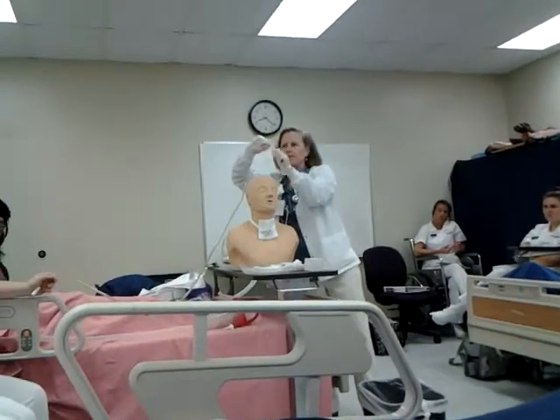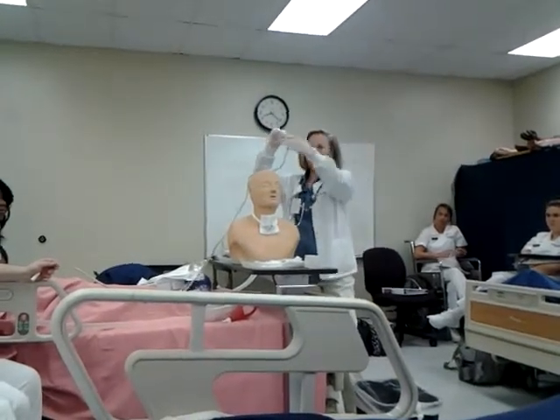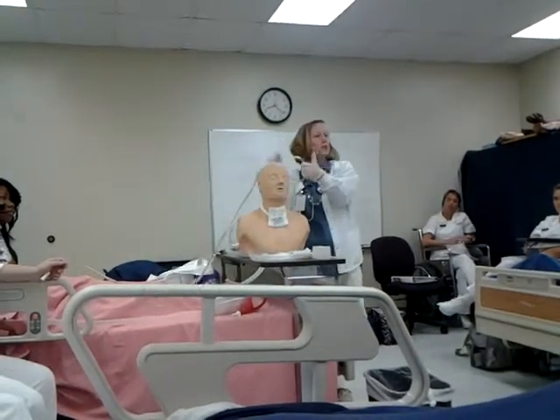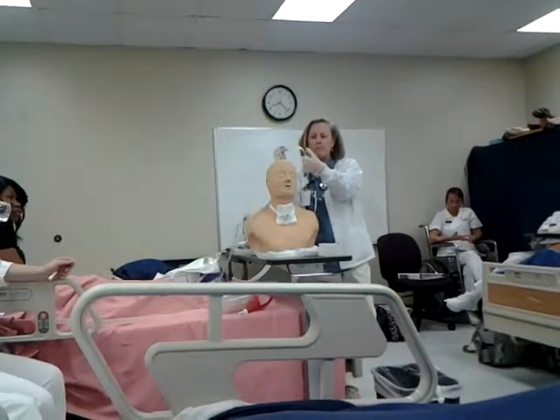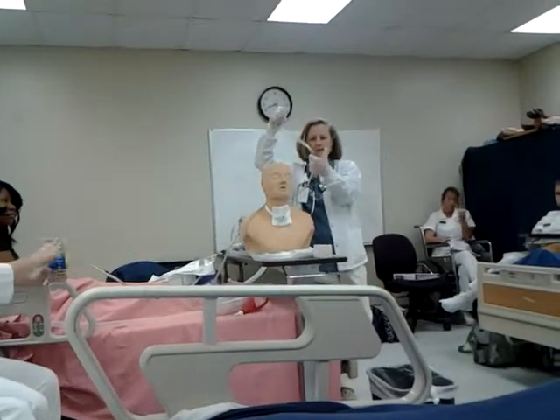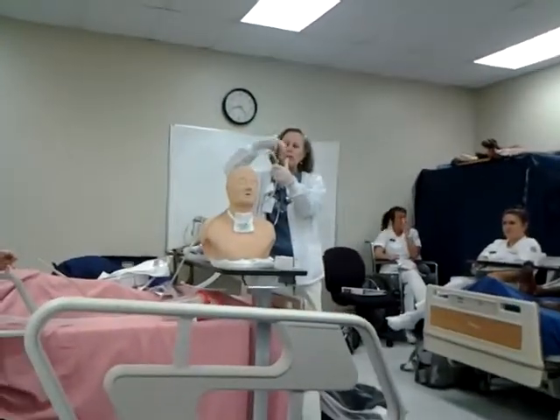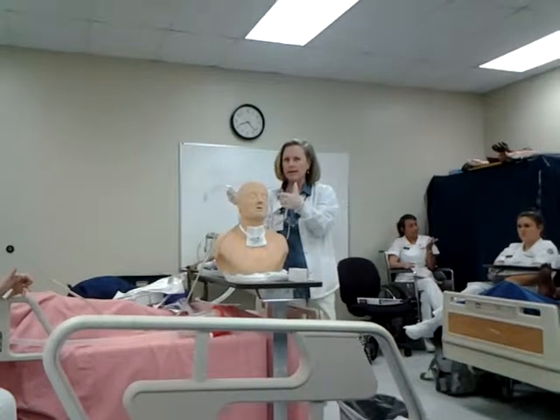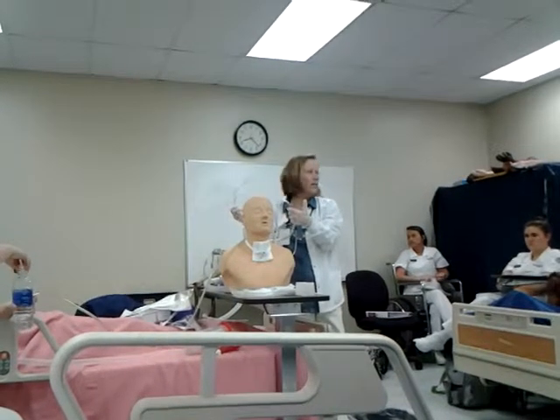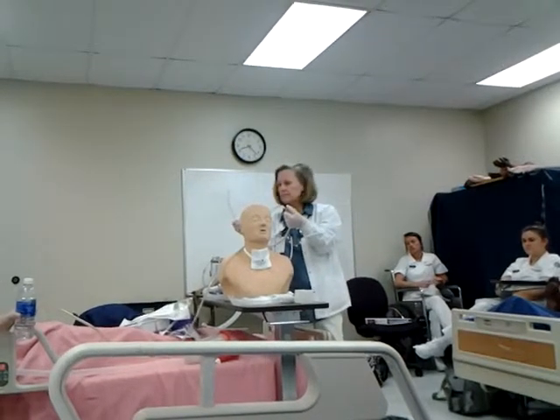You see how I'm doing that? Now, this hand is my contaminated hand. Do you see this little port? This port is like a drinking straw. When I put my finger here, I can suck through the straw, right? If I take my thumb off, I can't pull through the straw because the air will come through here. Have you ever had a straw that has a hole in it? And you try to drink from it, and what happens? You don't get what you want. Same thing with this. If you put your thumb over it, it occludes that.